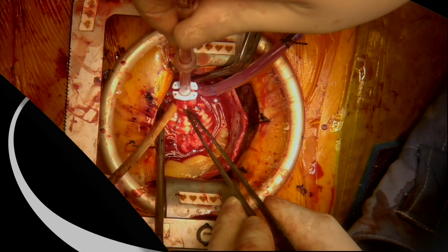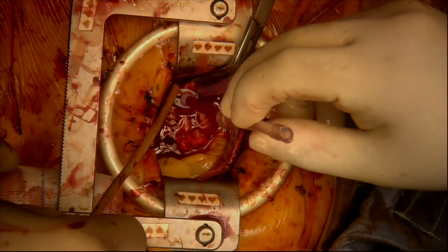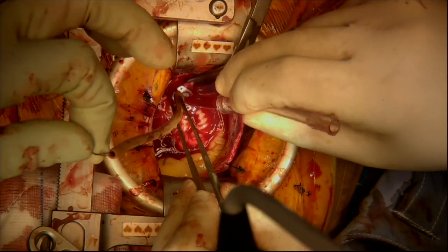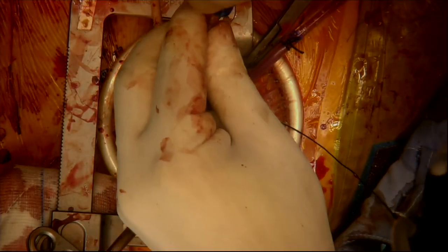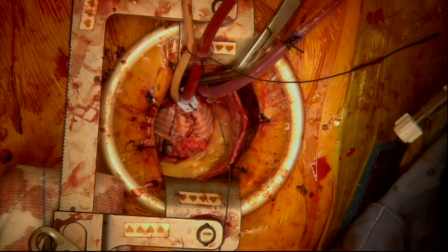A new purse string is placed for the root cannula in the ascending aorta. A new aortic root cannula is then placed, secured, de-aired, and connected to the vent section of the cardiopulmonary bypass machine.